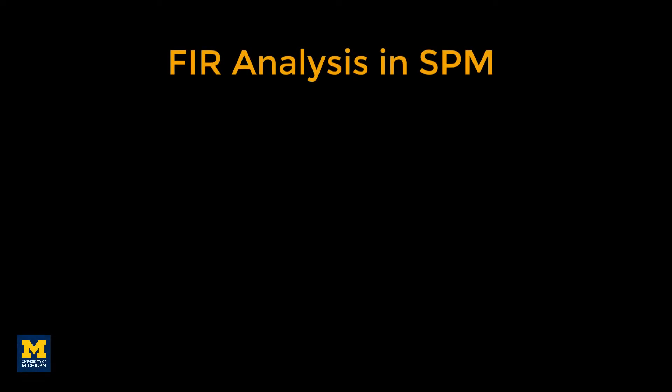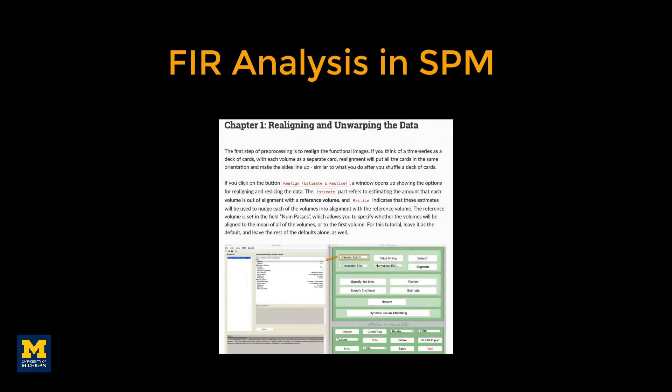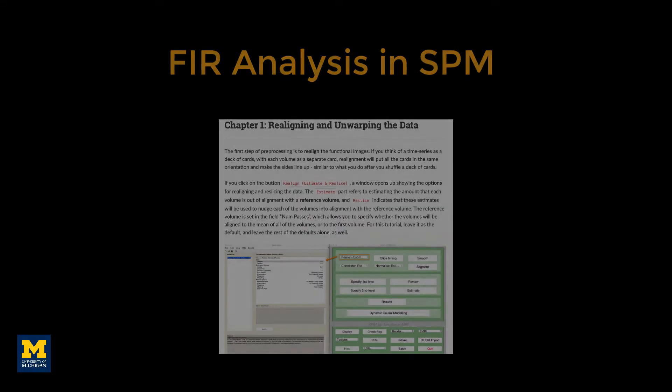Compared to FIR analysis in AFNI, using it in SPM is relatively easy. The preprocessing is the same as in the previous SPM tutorial on analyzing the Flanker task. The only difference is in how the first level model is specified for each subject.